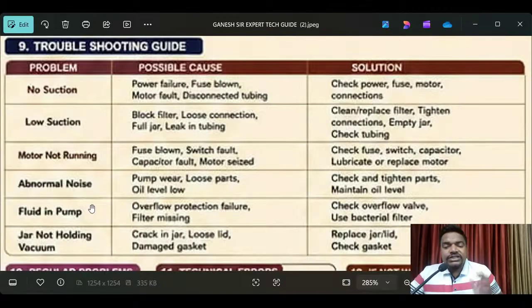So as a biomedical engineer, every engineer should have proper skills, and you should be capable of providing user training. User training is very important. As biomedical engineers, we have to provide training on all medical equipment to the hospital management, because at the end of the day, the reliability of the services and equipment should be ensured for safety, and patients should get proper treatment by using the technical medical equipment.